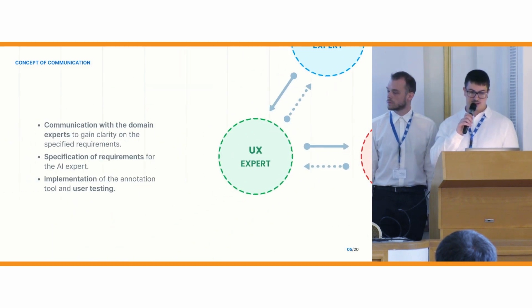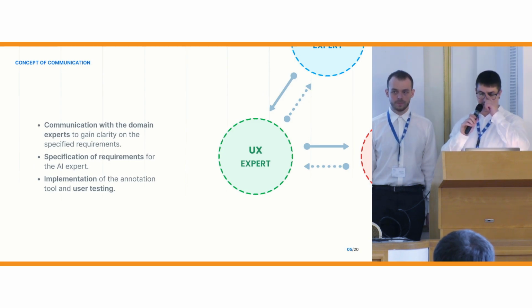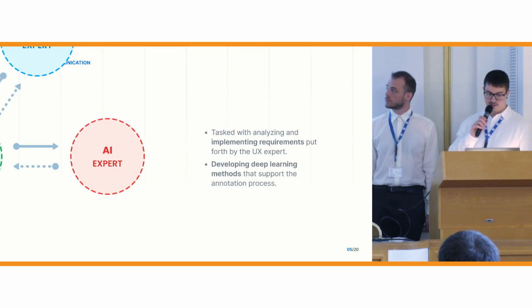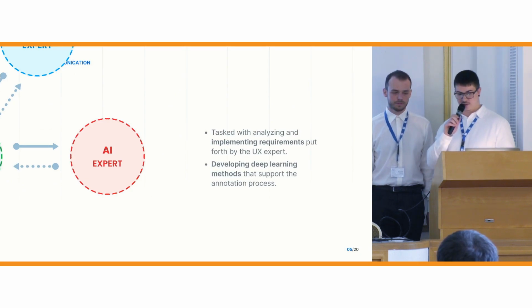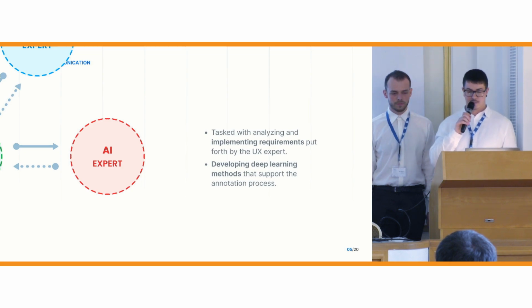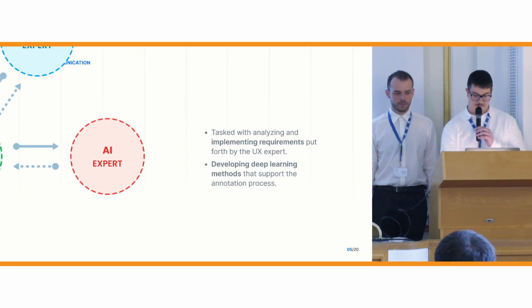The UX expert is responsible for communicating with the domain expert to gain clarity on the specified requirements, and the AI expert is tasked with analyzing and implementing requirements put forth by the UX expert, and they focus on developing deep learning methods that support the annotation process.